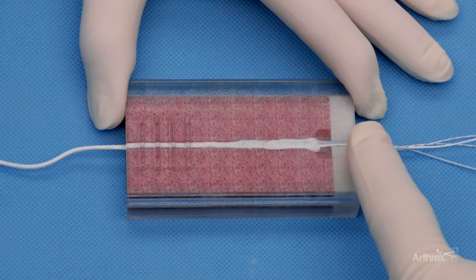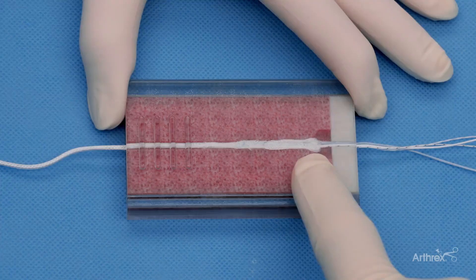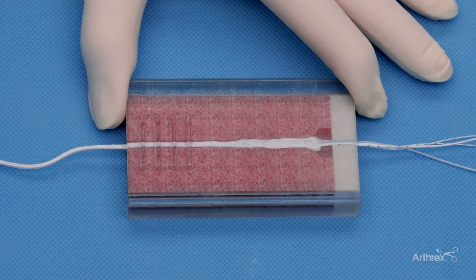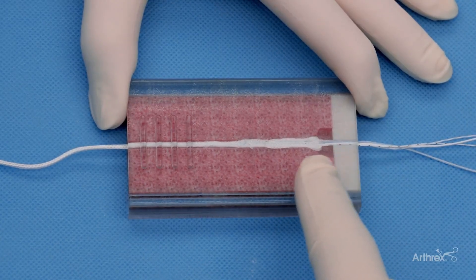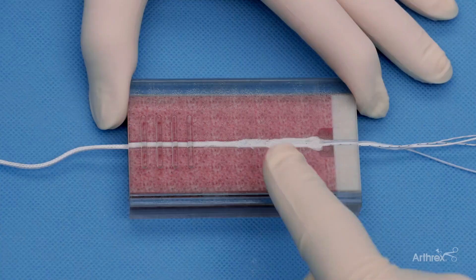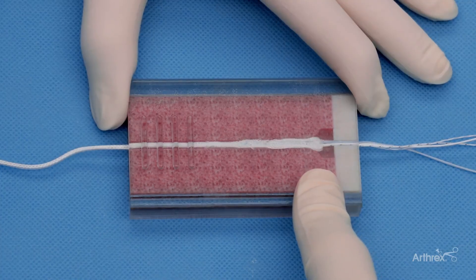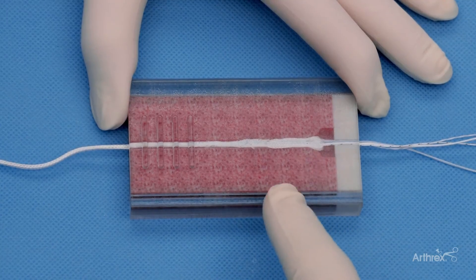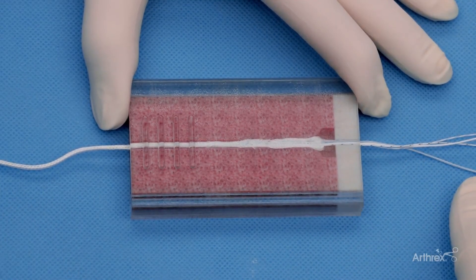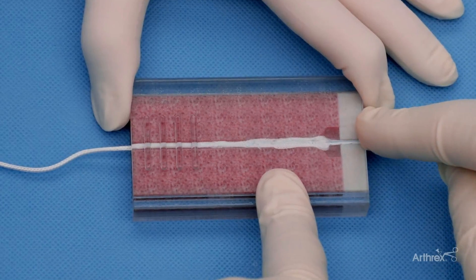Once the SutureLock Implant is deployed from the knee joint into the tibia in a retrograde fashion, the sheath comes into the cancellous portion of the tibia bone with the four repair sutures still coming out of the knee joint portal. Once the SutureLock sheath is just inside the tibia cancellous portion, you can get good tactile feedback to know that this has been put in the correct position. The SutureLock sheath is then bunched up under the tibia using a combination of gentle back and forth motion on the four repair sutures plus the meniscal SutureLock sheath deployment suture. This shows the unique nature of this implant as it is deployed underneath the tibia cortex.